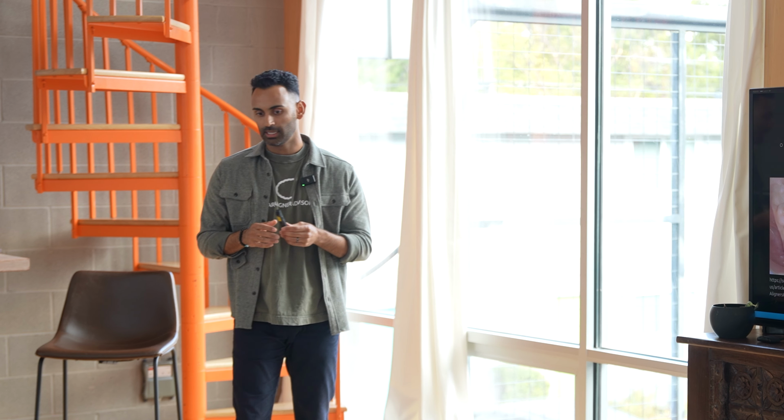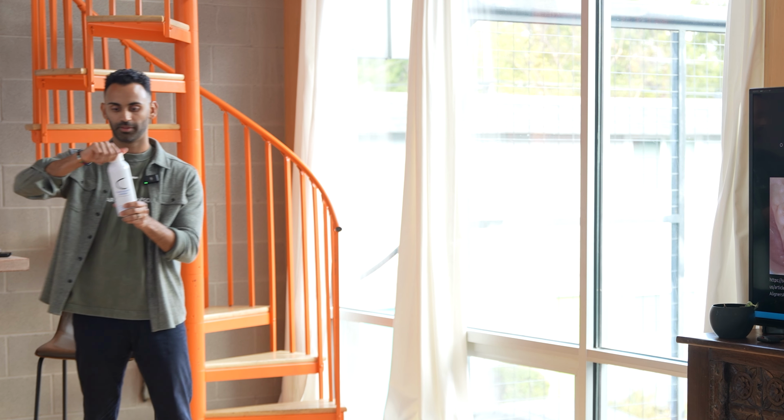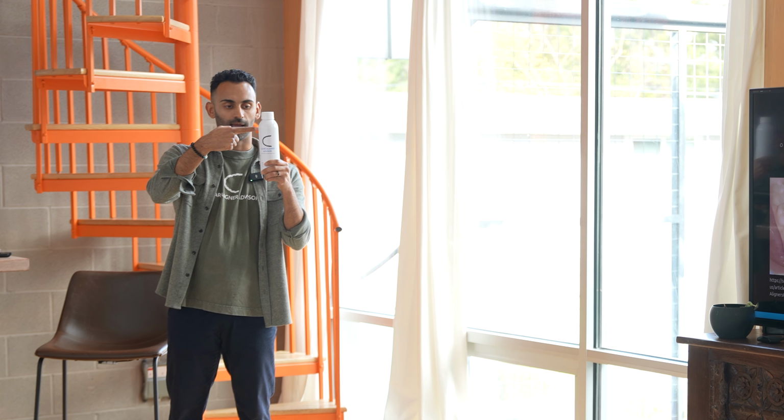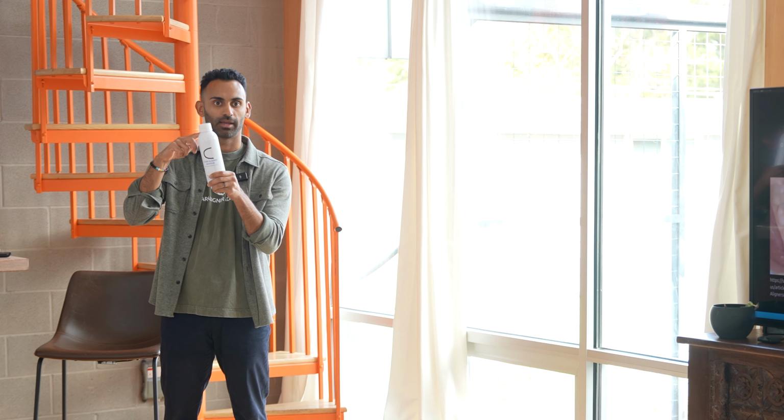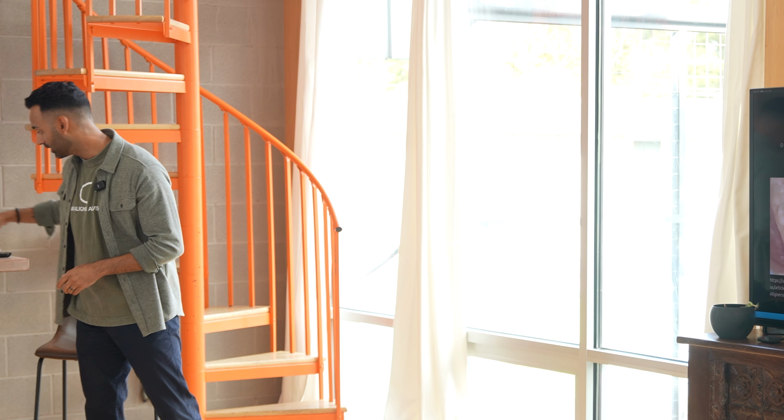So if you think about the crown of the tooth being above the bone level, and you try to put force to move this backwards, you see how this just tips out, right? The root stays here. What you want for translation is you want the whole thing to be pushed back. And so most of the movements with aligners is a lot of tipping, right? And when you're rotating, it's all kind of above the bone level. And to get those bodily translations, it is possible, but it takes longer because of the length of time that those teeth have to undergo that force.